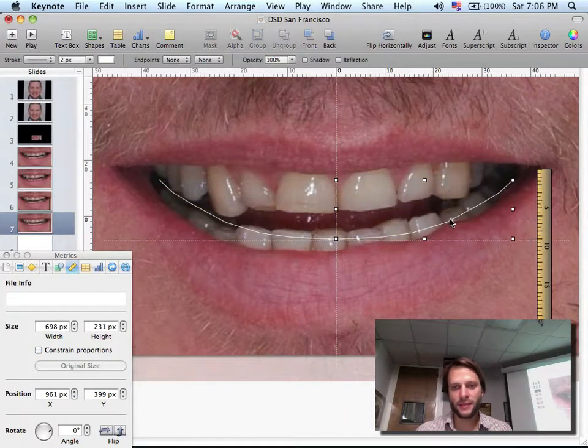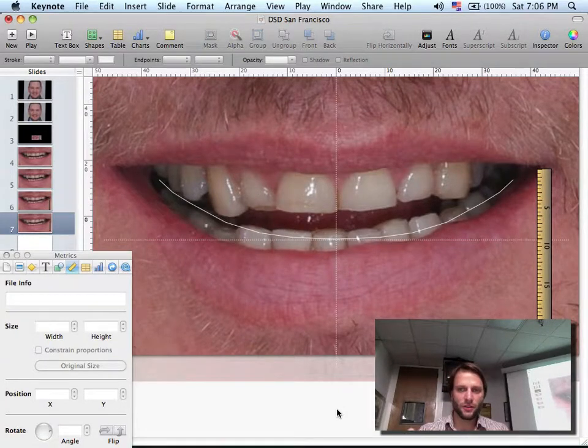So that's the right symmetric position of the curve. We can already notice the differences on the arch. We can already notice that you have a different relation with the lower lip, and that probably making a perfect symmetric smile will not fit him, because it's going to be too close to the lip on the left side, too far away from the lower lip on the right side, and also because it's probably impossible on his left side to build out the bicuspids that much.